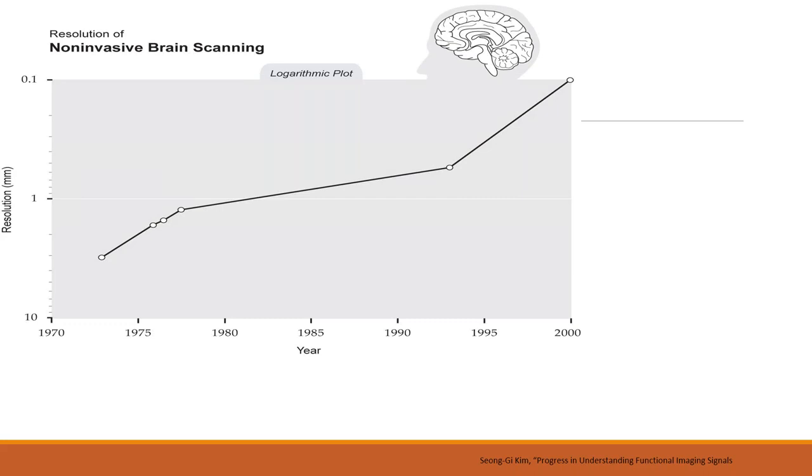Back in the time when that scanner didn't even do a full circle, it did a partial circle and cocked itself back to rescan again and had all that delay. Now that study, which was taking maybe 75 slices for that same exam, which might be a CT chest, might be 300, 400 slices or more based on timing, contrast, and what you're looking for. Huge data files that are now being moved across the network.